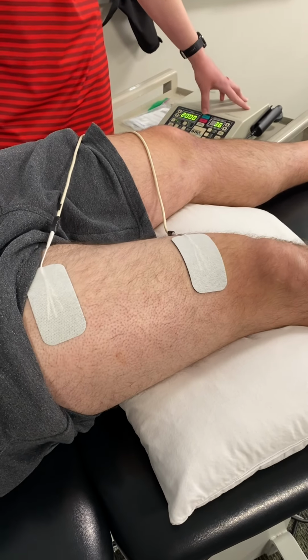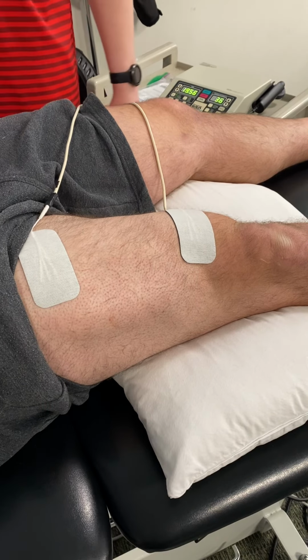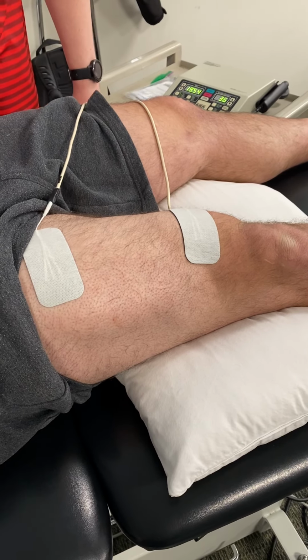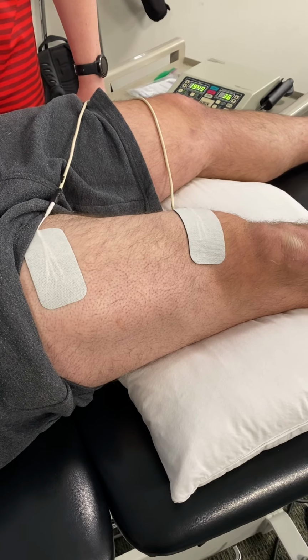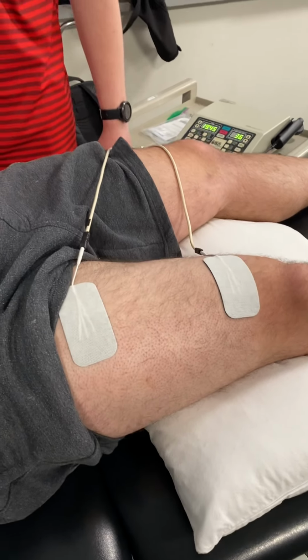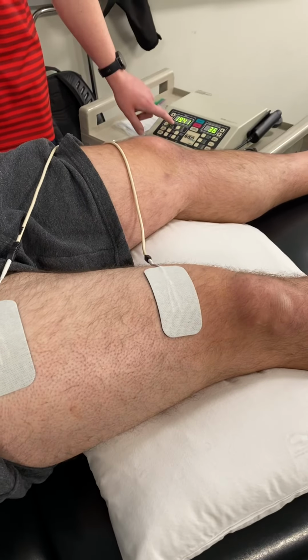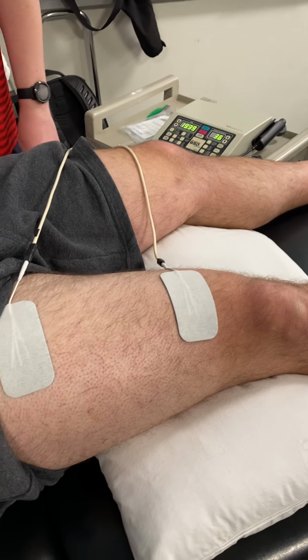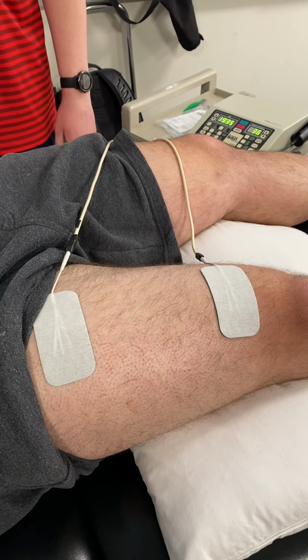Okay, now I'm going to go ahead and press start. He's going to contract with the stimulation. Then I'll have him relax after. Okay, and we're going to do 2 of those. We're going to go for 20 minutes, so we know that he's going to do 20 contractions because we're getting a 10:50 duty cycle, 1 contraction per minute.